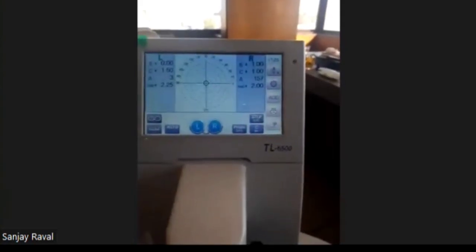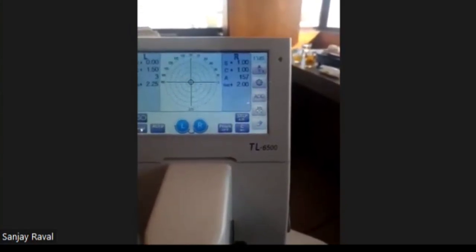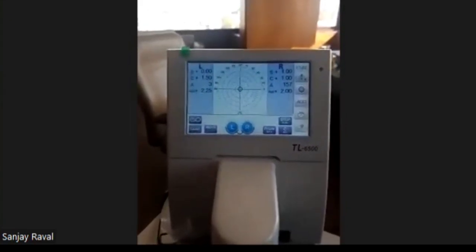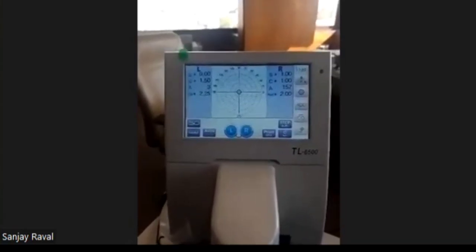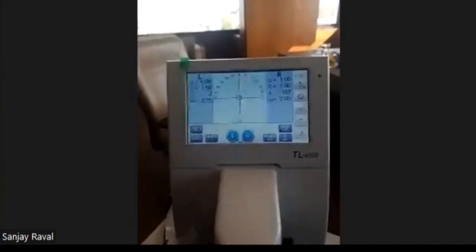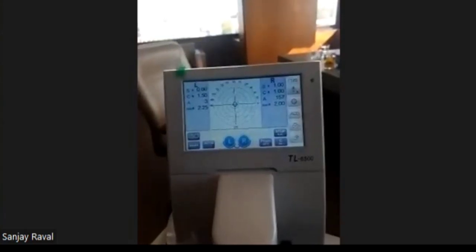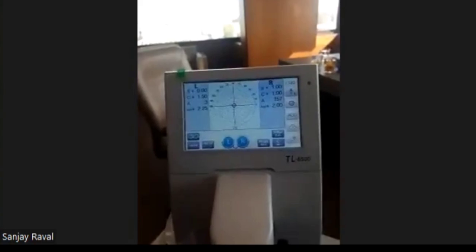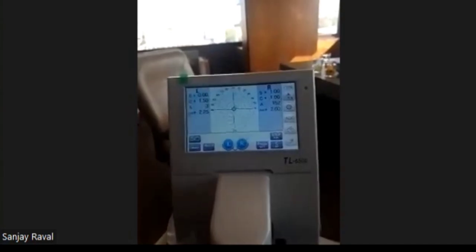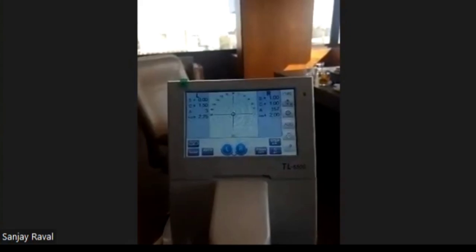Because cylindrical lenses, definitely they are very much crucial in fitting, and the PD, the pupillary distance between two lenses. Even if your refraction or your prescription is perfect, if the fitter makes a mistake, the patient will complain that I got my eyes checked at this doctor and I'm not comfortable. Ultimately, you are not at fault. The fitter's mistake will turn out to be a punishment to us.